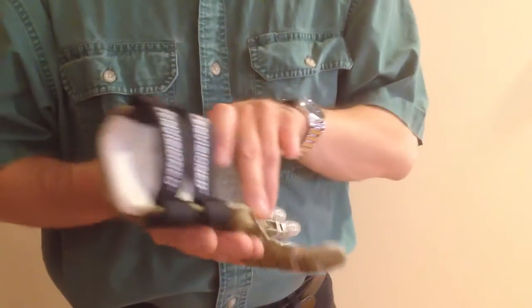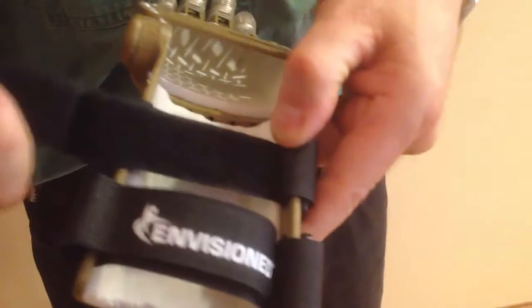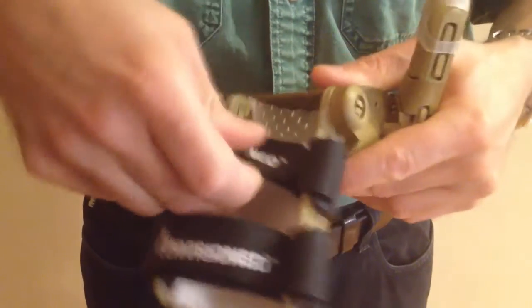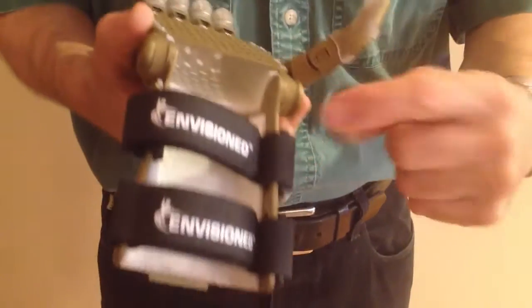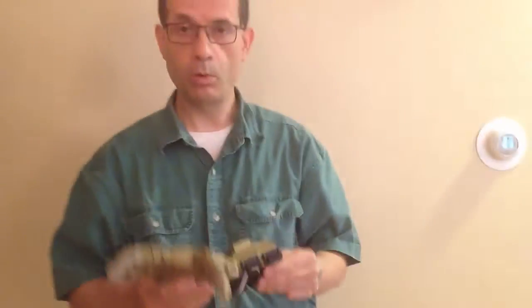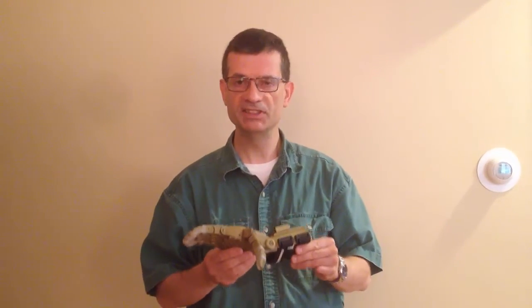And one final thing — let's take a look at the Velcro straps. These straps are attached on the thumb side of the gauntlet. The attachment is on the same side as the thumb. If they were attached on the other side, the hand would be more difficult for the recipient to put on and off themselves. So make sure that they are attached on the thumb side. With that, you should have a quality hand that is ready for use by a real-world recipient. Thank you.